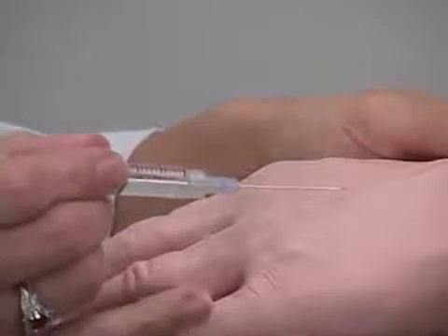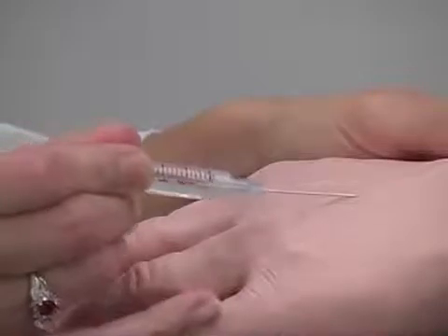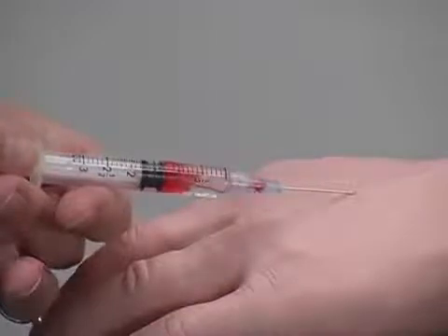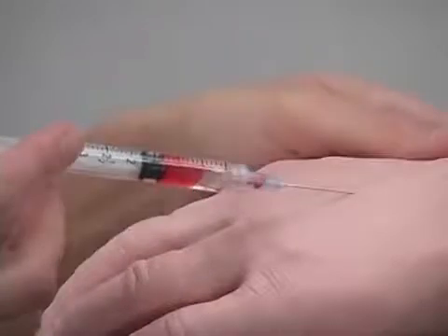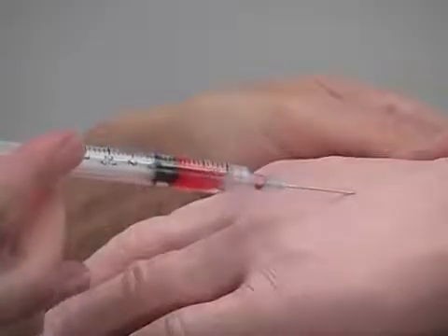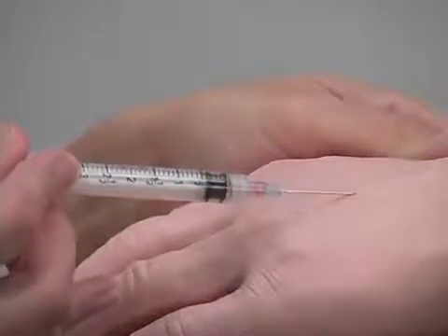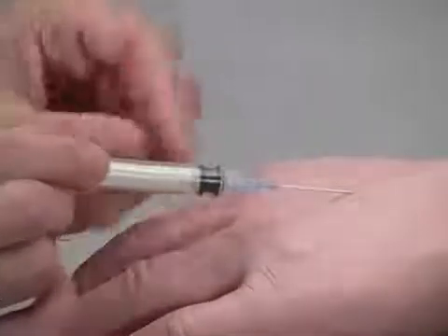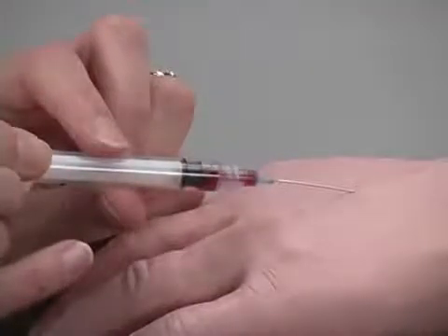To inject fluids, use a small diameter needle, either 20 or 25 gauge. Puncture the skin and vein, test for realistic flashback, and inject liquid into the vein. To withdraw blood, insert the needle into the vein and withdraw the synthetic blood.